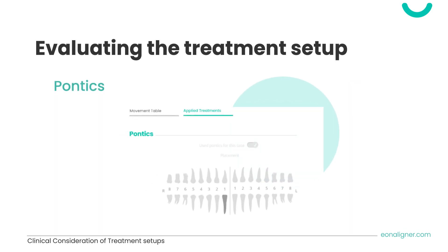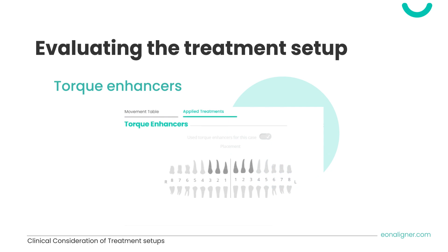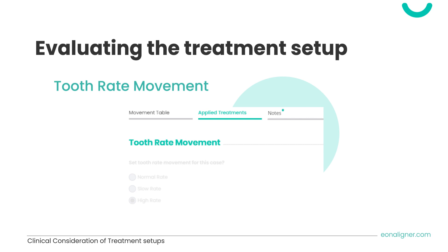When a pontic is requested, ensure it is applied for the correct tooth — it will appear in a different color. Torque enhancers are placed only on anterior teeth, either to preserve their buccolingual inclination during retraction or to change it when needed. The rate of movement is applied depending on case type, movements, and periodontal status — for example, a slow rate for compromised periodontal conditions or a high rate when the number of aligners is limited. The rate — normal, slow, or high — is determined by EON's treatment planning team and appears in the applied treatments section.